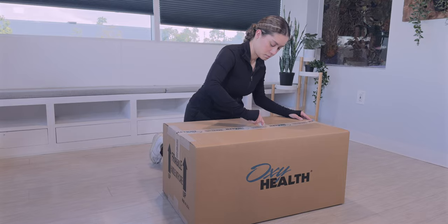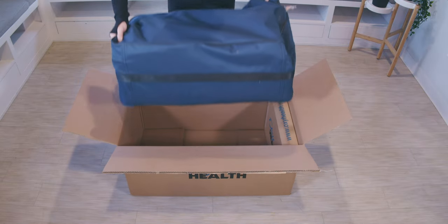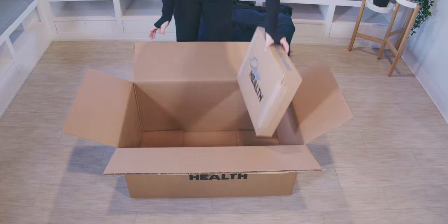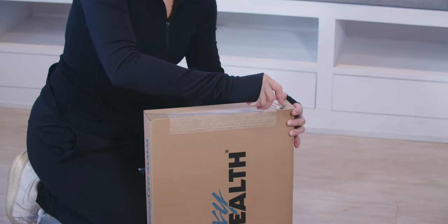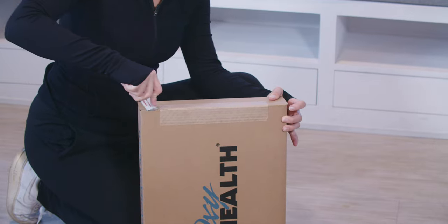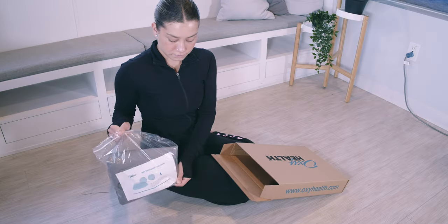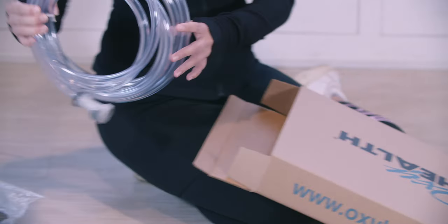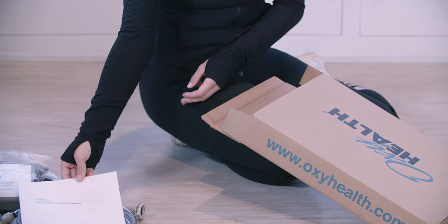Next, open the chamber box. Remove the carry bag with the enclosed chamber and set it aside. Also remove the accessory box. Open the accessory box. Inside you will find the muffler in its pouch, the mattress sheet in its pouch, the air hose, and the printed chamber manual. Set these aside for now.